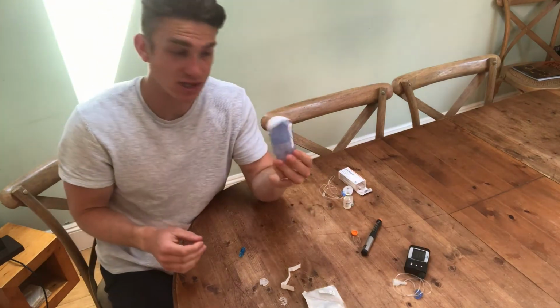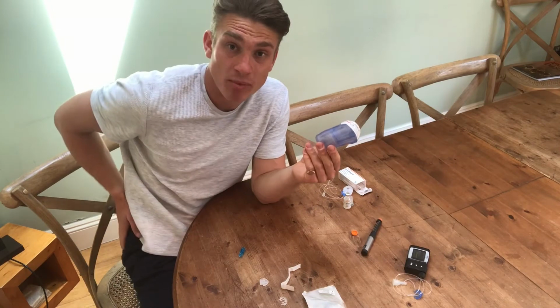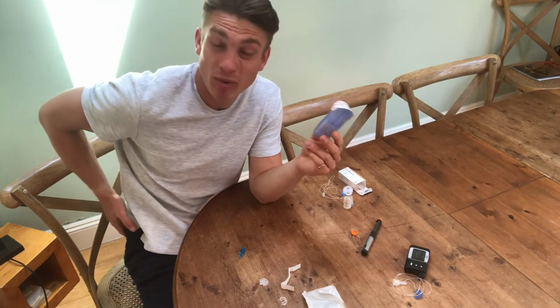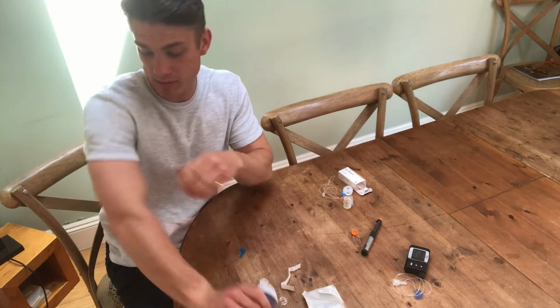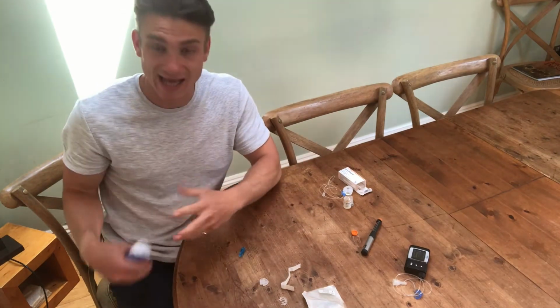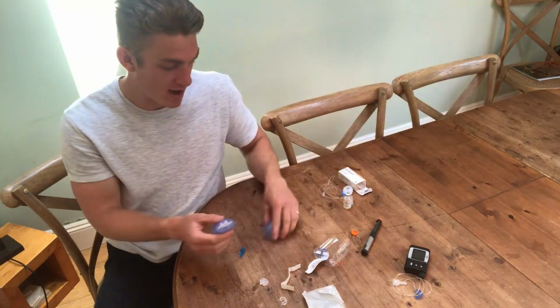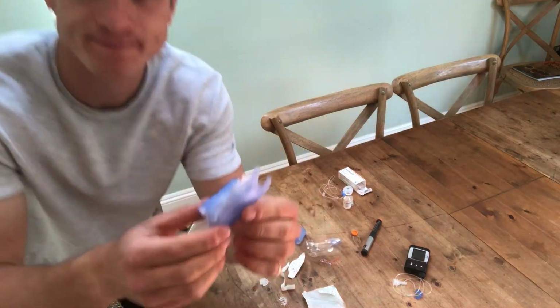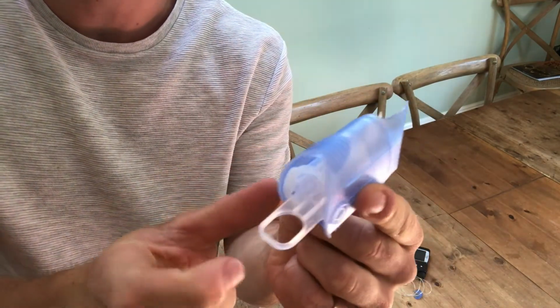The next bit I need to do is actually fit it to my skin, to my body, and I put it just below my back, just at the start of my hip here. People put it on their stomachs, on their abdominals, people put it on their arms, the back of their arms, on their legs. I like to put it just at my hip. So basically you have this compartment here. This is where the cannula comes from.